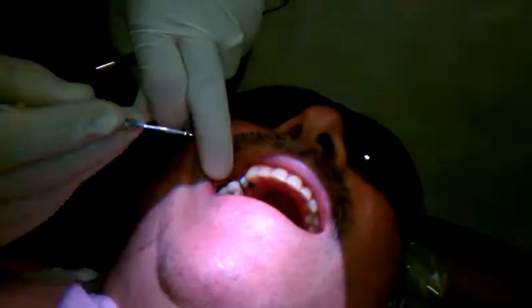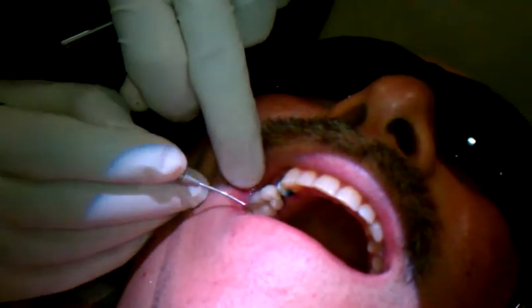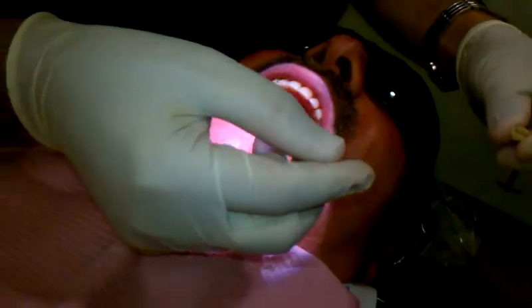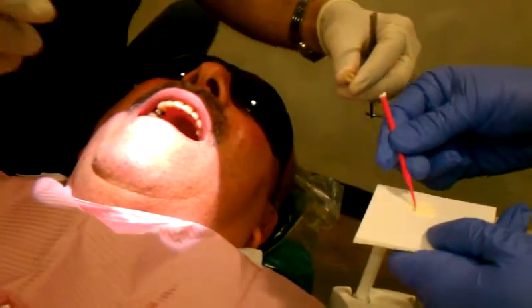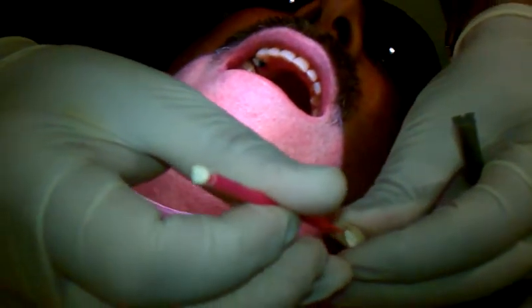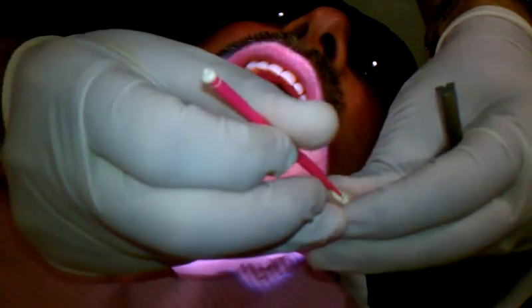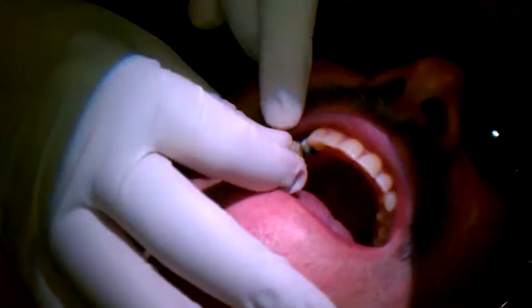You always want to make sure that there's no excess temporary material in the grooves of other teeth, so that the occlusion will fit well. I'm going to cement with Temporan. Because the fit is really good, there is really no need to put a whole lot of cement — just a little bit to coat the inside. I usually do not want to put cement right at the margin, because that's going to flow out when the patient bites down.